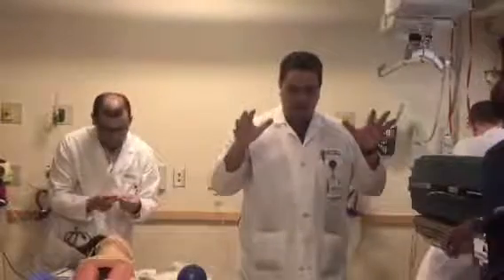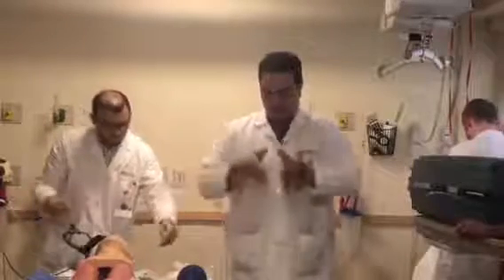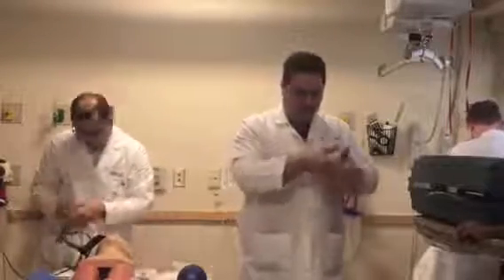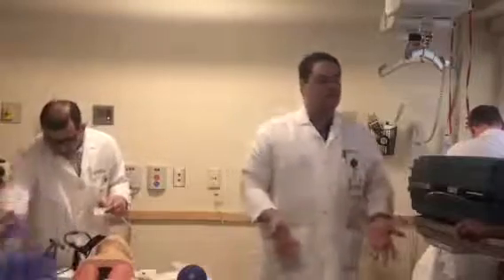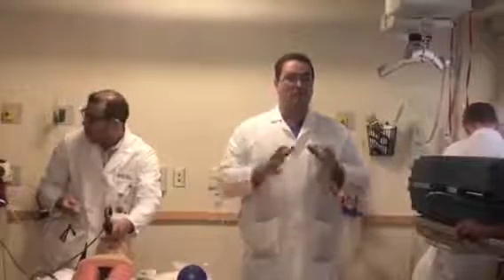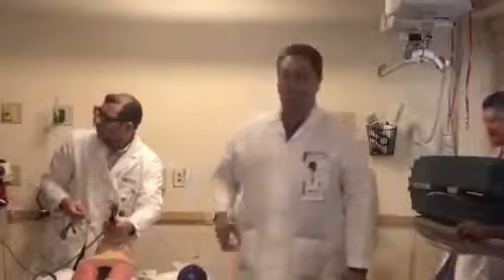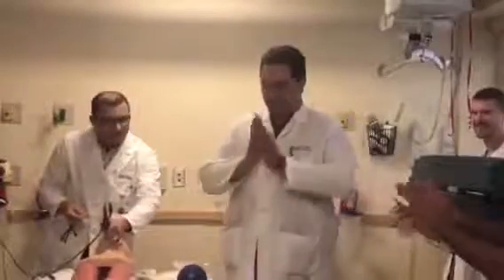You have a disaster: ambu bag with 1 million people. Good, glidoscope. Bad, intubating LMA, combi tube, trach. How much easier could it be? That's your whole disaster management in an airway, so you don't lose the patient. Other stuff you can remember later. Okay? Thank you. Good job.